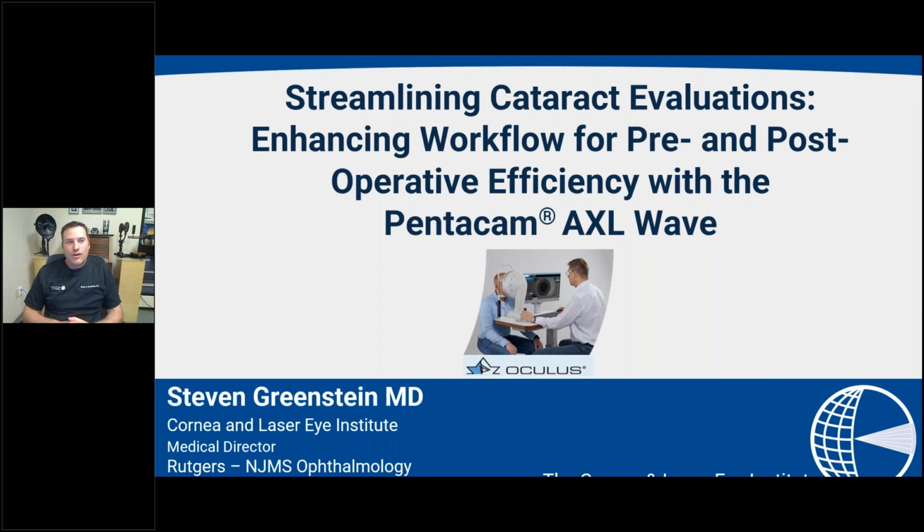So tonight we want to go over streamlining cataract evaluations to enhance your workflow, both pre and post-op, with the Pentacam AXL Wave. And what I hope to convey over the next 45 minutes or so is really both how the AXL Wave can help you improve your workflow for routine cases, for routine cataract surgery, but also how it can really help you evaluate some of the more complex cases that we see, where it takes the complex decision-making that is required and really breaks it down and makes it much easier and much more routine to be able to make the right clinical decision for our patients.